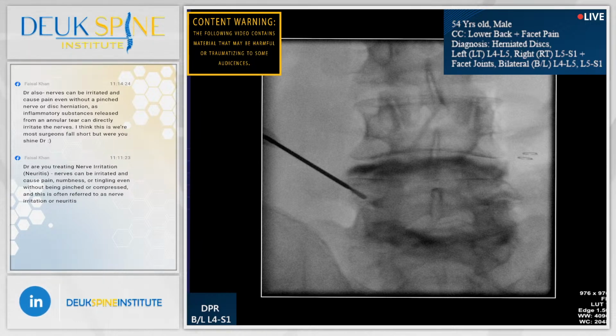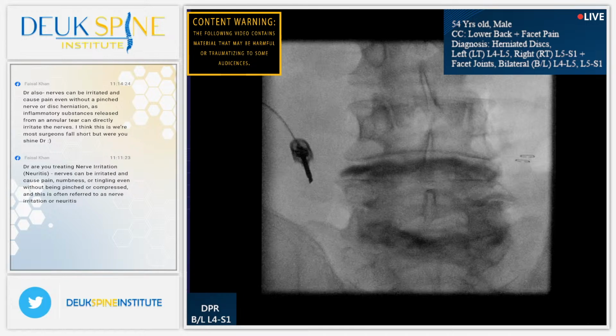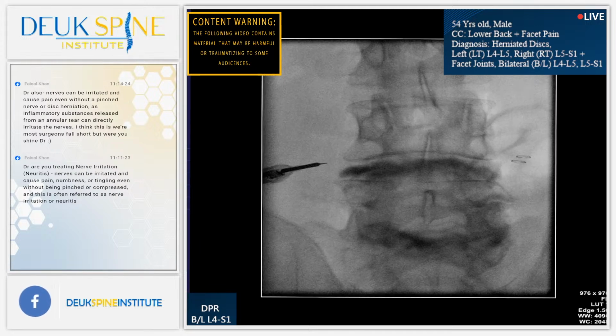Okay? Shot? Too low, probably. So, give me a second. Shot. Got to get to the transverse process here. Shot. I'm trying to get to the L5 transverse process. I keep slipping off of it. Probably its shape is a bit unusual. It's like a triangle shape.